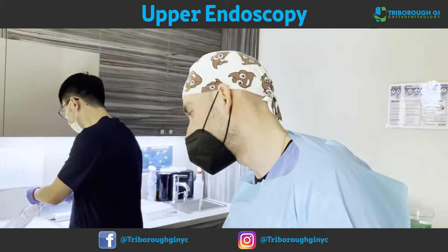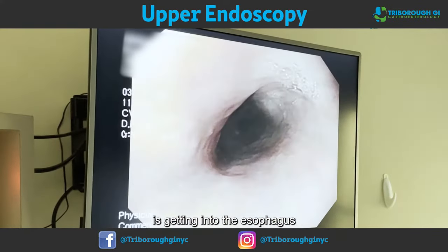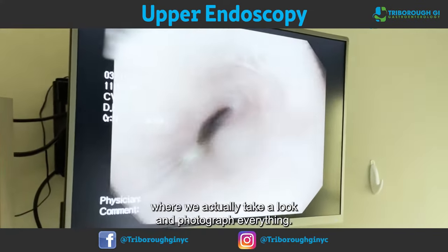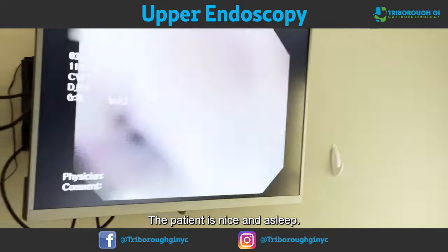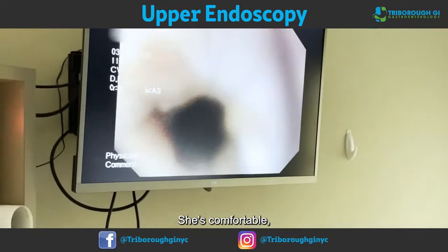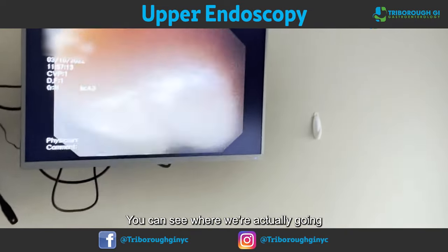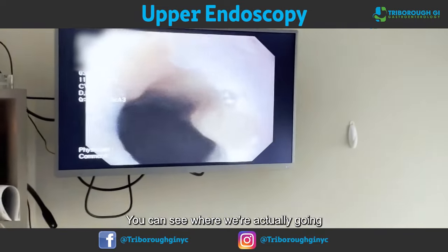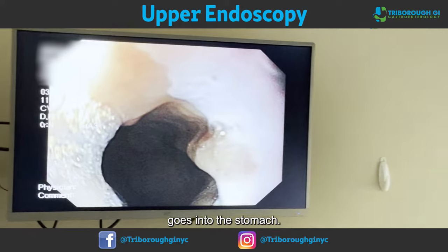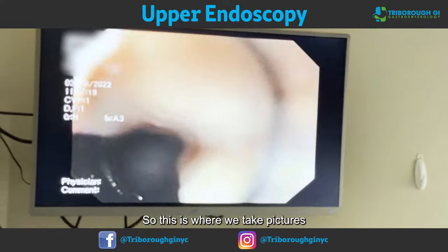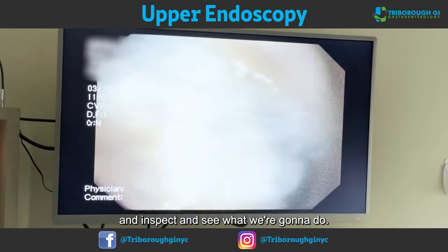The first portion of the endoscopy is getting into the esophagus, where we actually take a look and photograph everything. The patient is nice and asleep, she's comfortable. Making our way down, you can see we're going to where the transition of the esophagus goes into the stomach — this is where we take pictures and inspect.